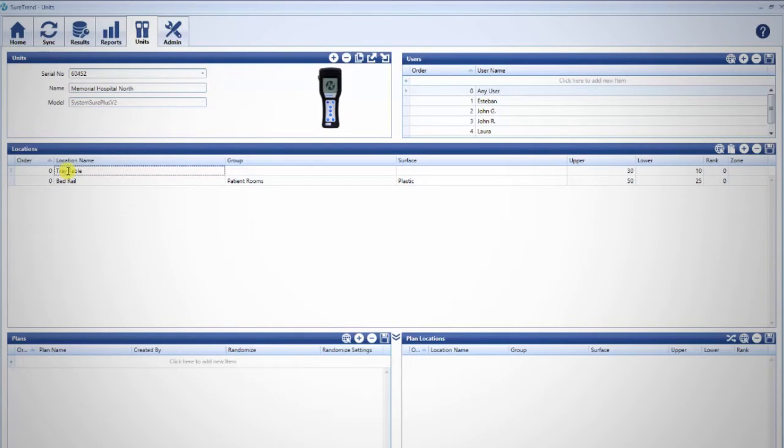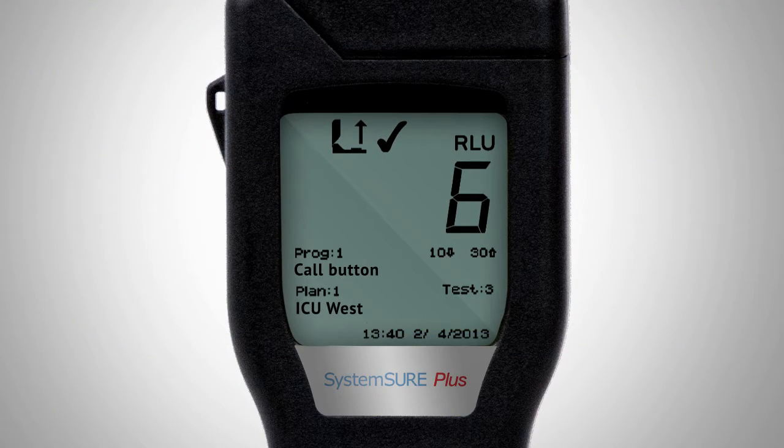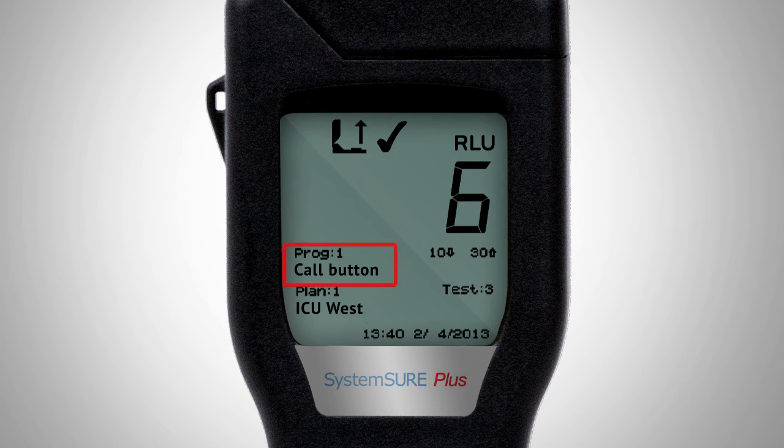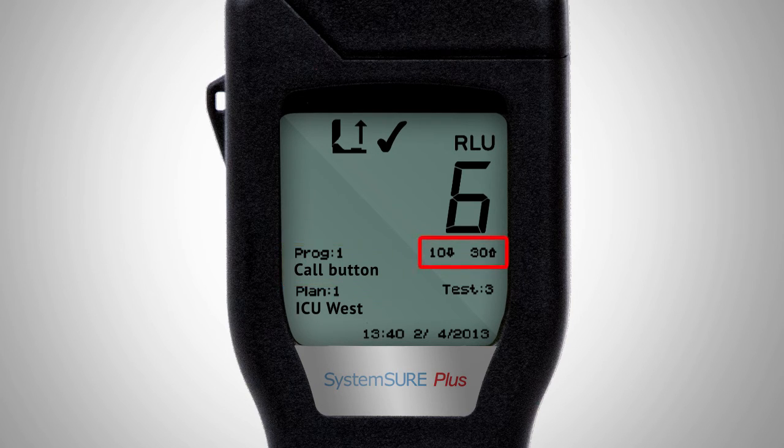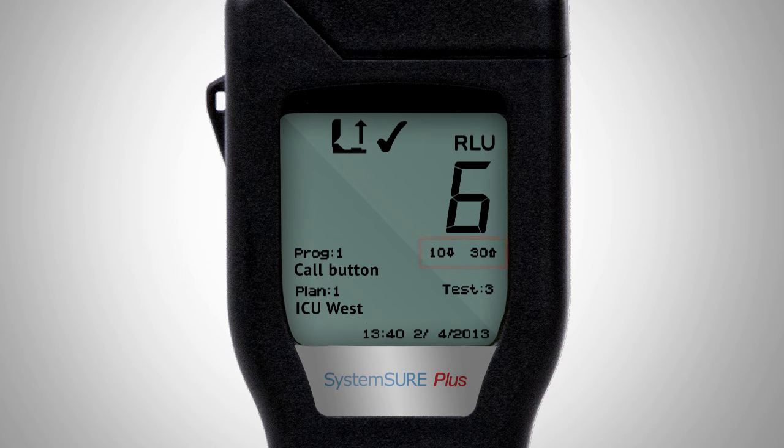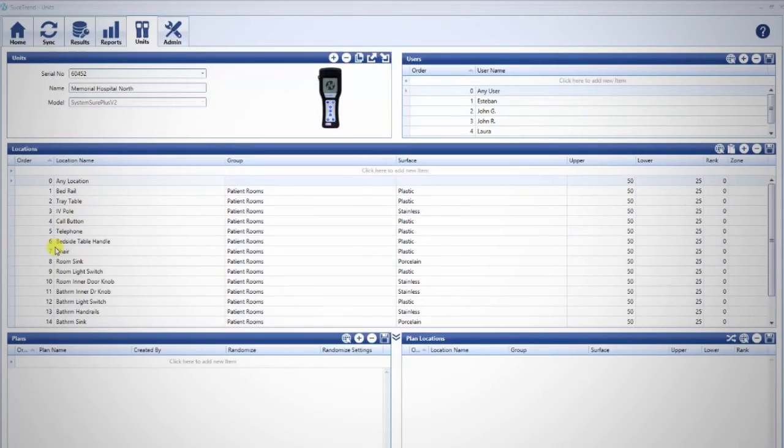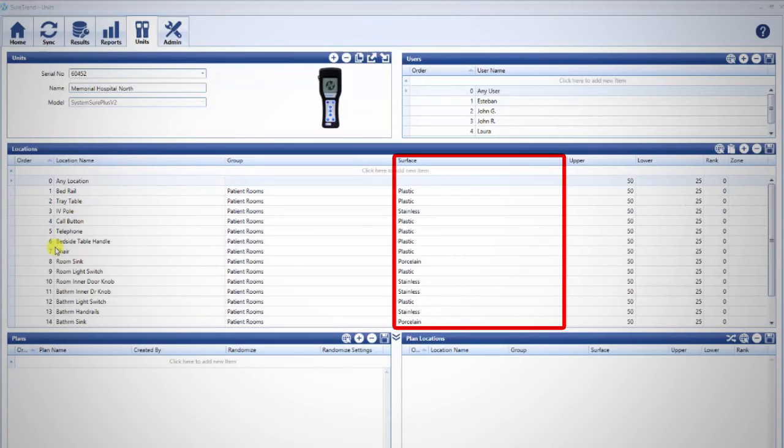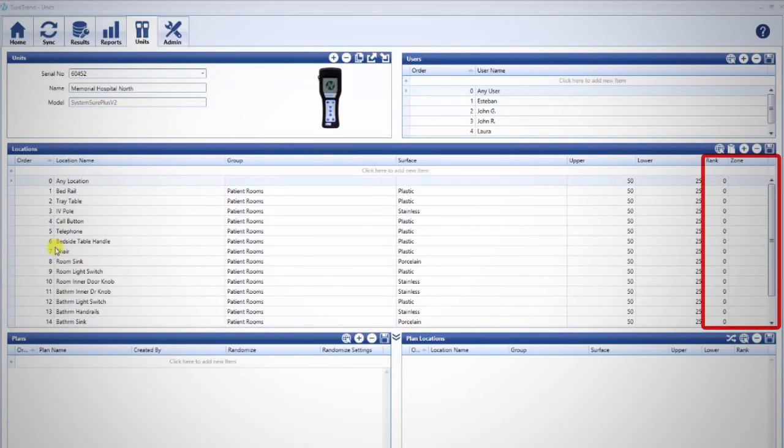On the System Sure Plus, the fields displayed on the System screen include Location Name and Upper and Lower Limit. Other fields are used for tracking and reporting purposes in SureTrend, and though they are not required fields, they will help you run a more data-powered, thorough cleaning verification program.